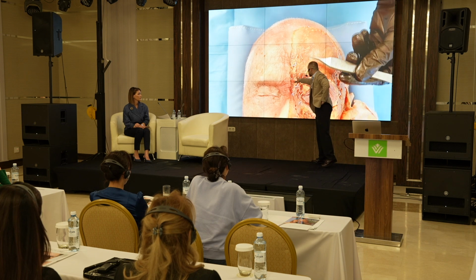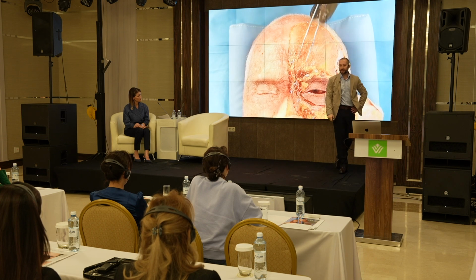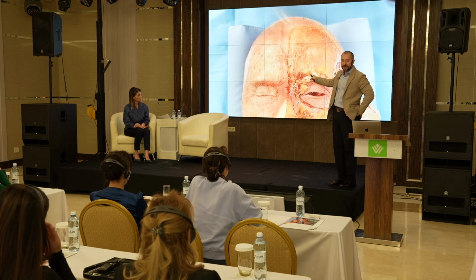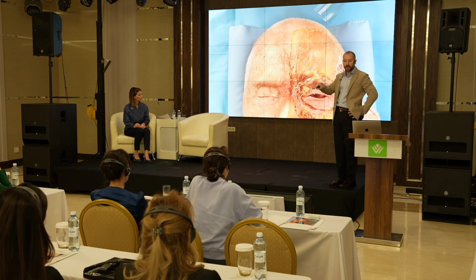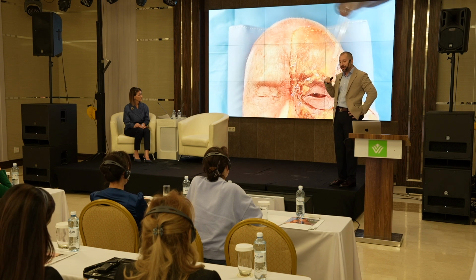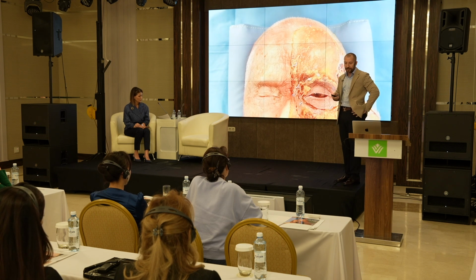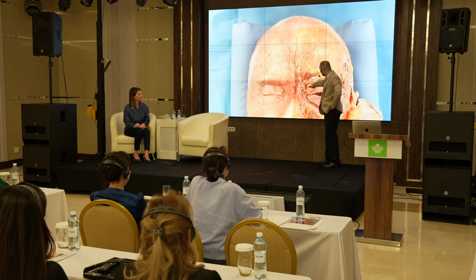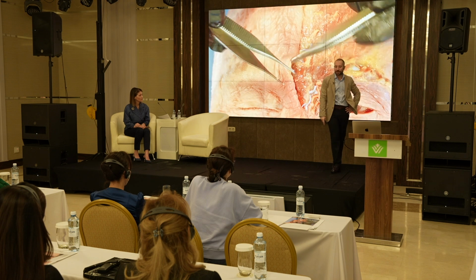And you can see this reddish procerus, and this one is the corrugator muscle. It's more dark red. And this is the frontalis muscle, as I showed. If you inject with a needle underneath this layer, it's also quite safe in the forehead area. But of course, underneath this layer with a cannula, it's even safer to inject. And in the glabella area, the internal carotid system and external carotid system come together, one of the most dangerous areas, in the glabella and the dorsum of the nose.